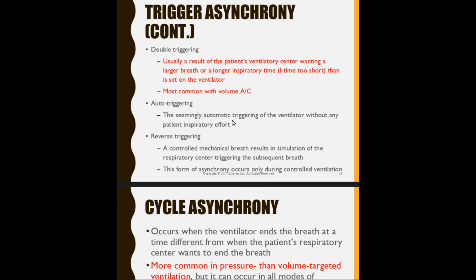Reverse triggering. It's basically a controlled mechanical breath that results in stimulation of the respiratory center triggering the subsequent breath. This form of asynchrony occurs only during controlled ventilation.